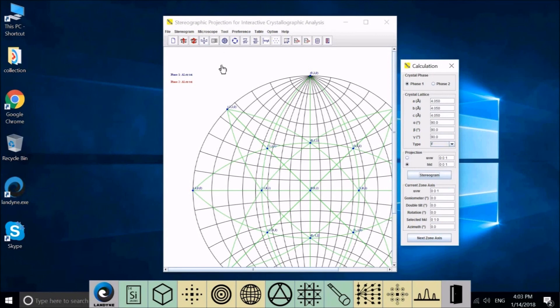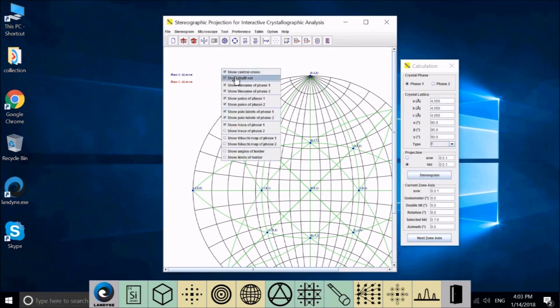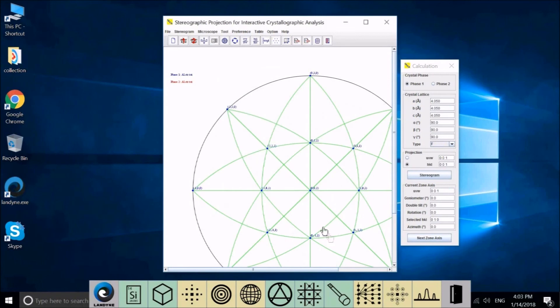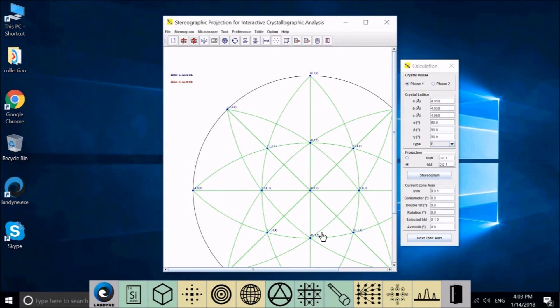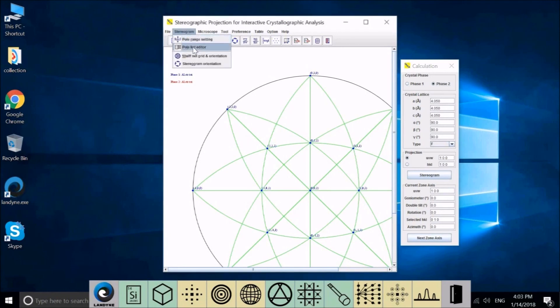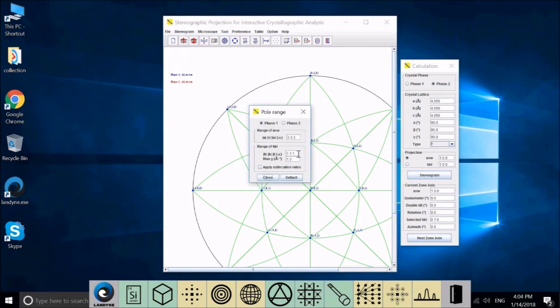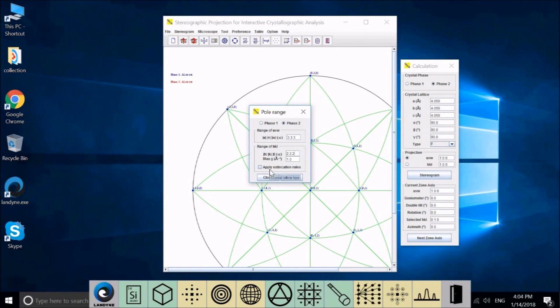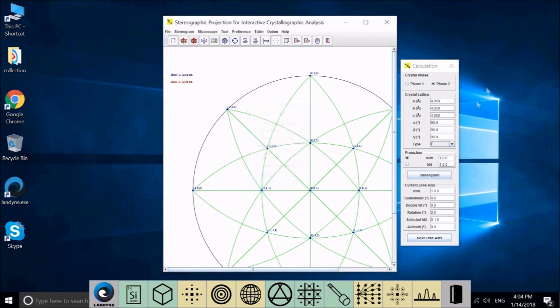If two phases have a fixed orientation, you can load these two phases in, and the composite stereogram will show the whole orientation relation between these two phases. Now let me show you how to make the trace lines together with the stereogram. I'm going to load both phase one and phase two to aluminum.